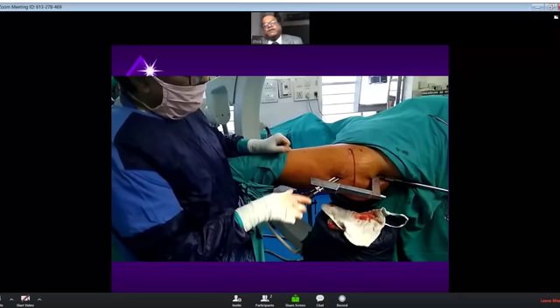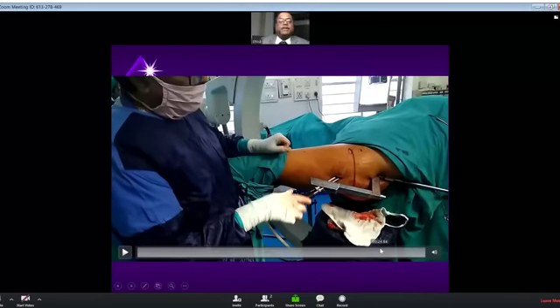Normally, if I use a superior screw of 70 millimeter in a 135-degree nail, I select an inferior screw 15 millimeter longer, that is 85 millimeter. And if I am using a 130-degree nail in an elderly patient, it's a 10 millimeter difference. And after passing both these screws, I compact both of them.